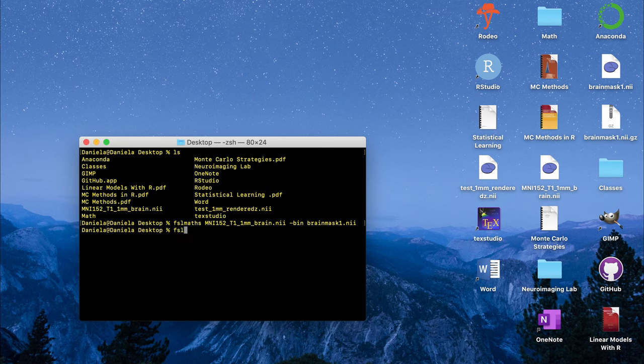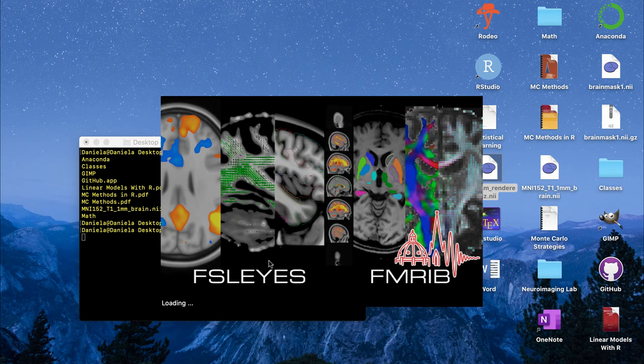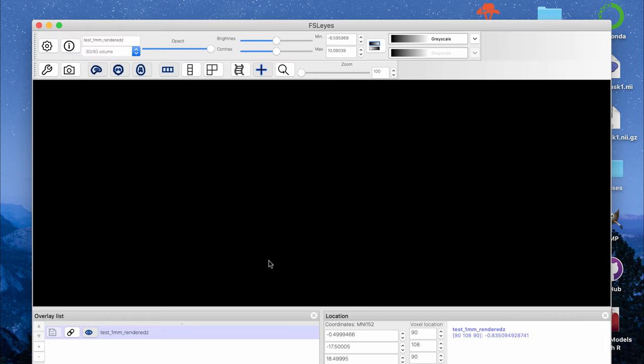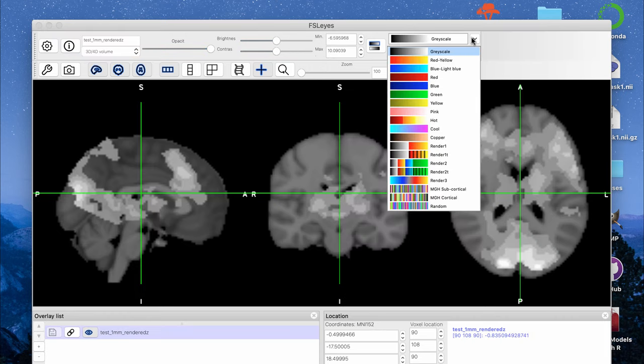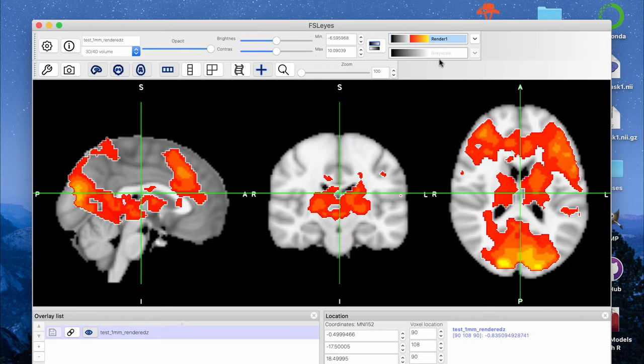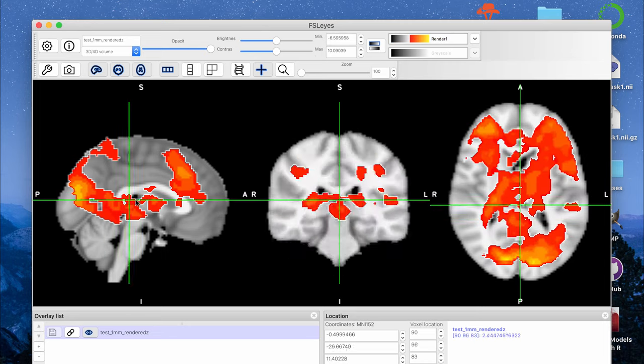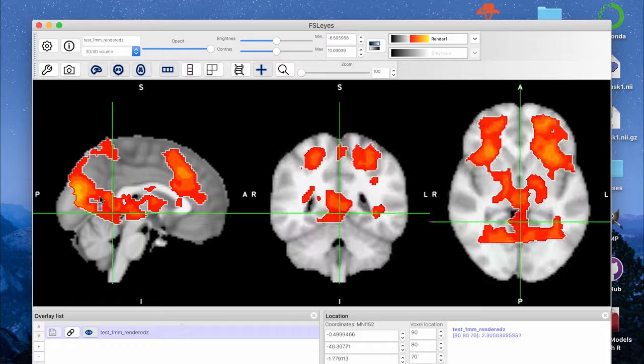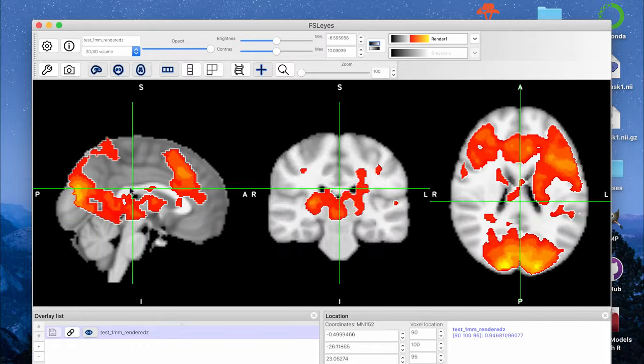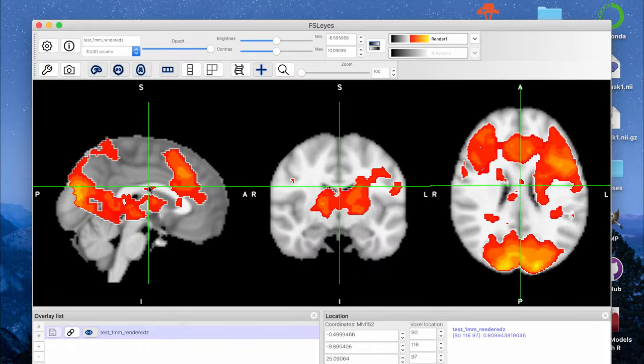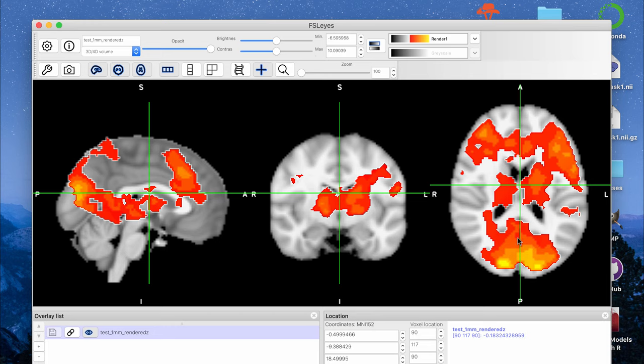I'm going to do it based on an fMRI map. The second example is going to be this nifty file and this is the result of an fMRI study that was done. I have a brain fMRI activation map that I'm going to open up now and then I'm going to change the scale to render one and that will show me the activation map that I have. This is in three dimensions because it's a nifty, so I have some activated areas. The analysis was based on a z-score of greater than or equal to 3 would be considered activation, so anything that's red is going to have an intensity value of at least three.